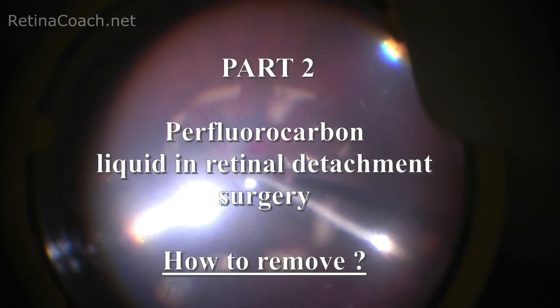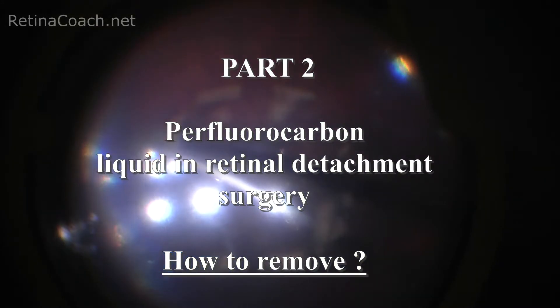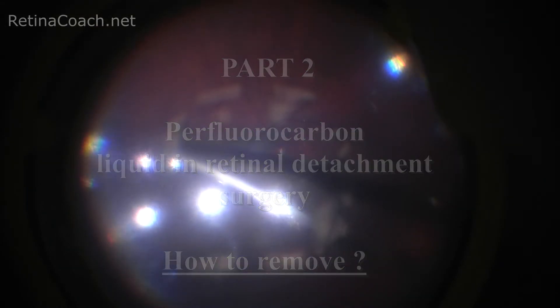This is Anfisa from Retina Coach, and this video addresses the technique of perfluorocarbon liquid removal from the vitreous cavity.